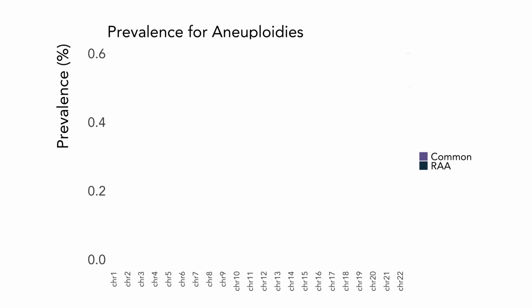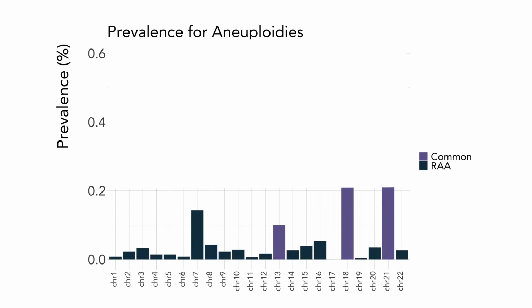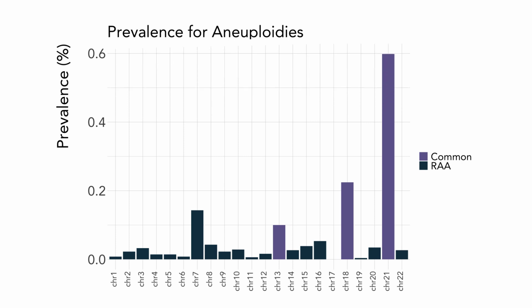This capability to screen for aneuploidies other than the ones identified in chromosome 13, 18, and 21 is clinically important because such aneuploidies may be associated with placental mosaicism, uniparental disomy, and true fetal aneuploidy. We performed a retrospective analysis of 49,000 samples and characterized the prevalence and the degree of mosaicism of chromosomal aneuploidies. To estimate the prevalence of each chromosome, we examined high-confidence positives characterized with Z-scores, which reflected the significance of enrichment or depletion in WGS read density.